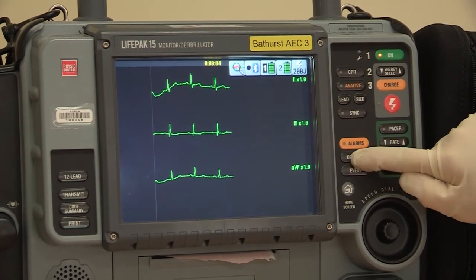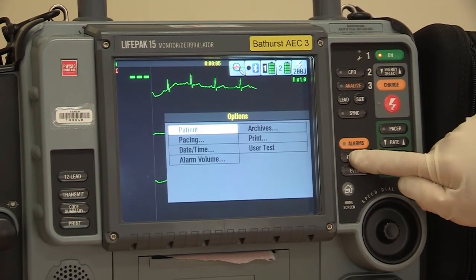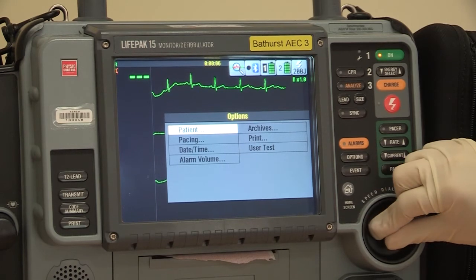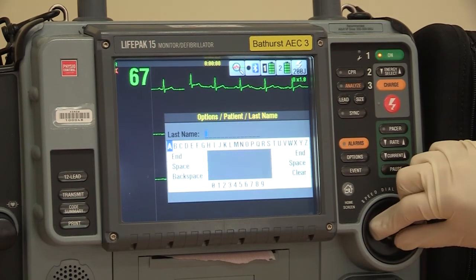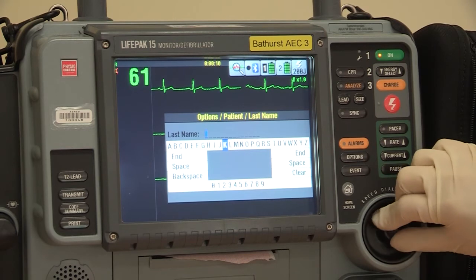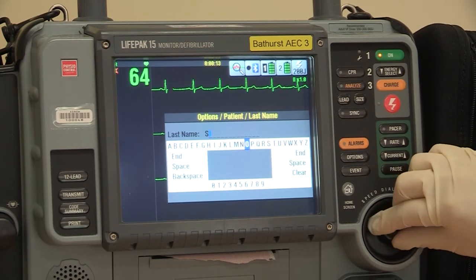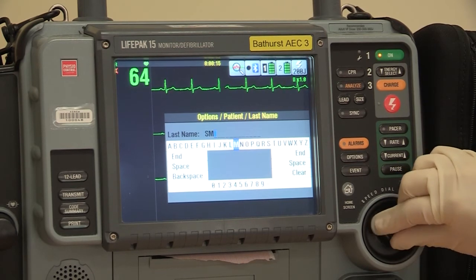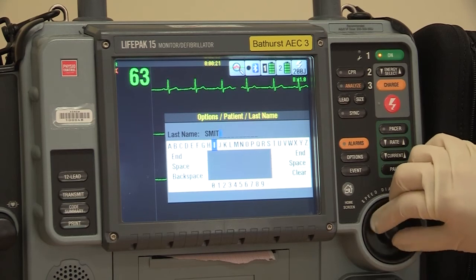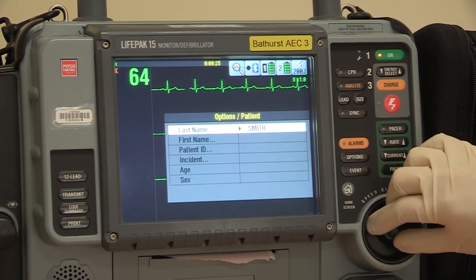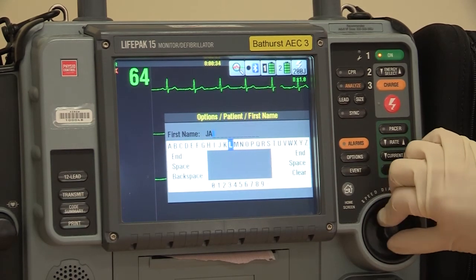Press the Options button — this is the button to the right which states 'Options'. The top word 'Patient' should be highlighted. Press the knob on the right again to select this. Enter in the patient information by twisting the knob to scroll through the letters and pressing the knob to select each letter. By rotating the knob through the various selections, you can then exit out and back to the menu to transmit.